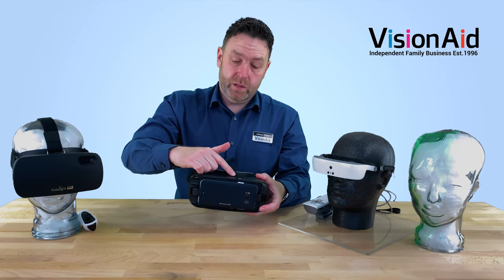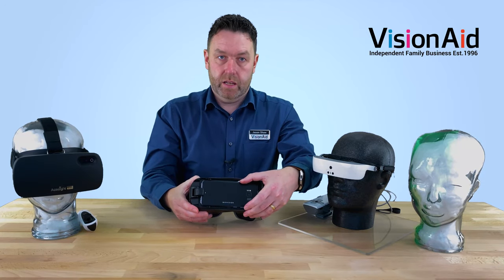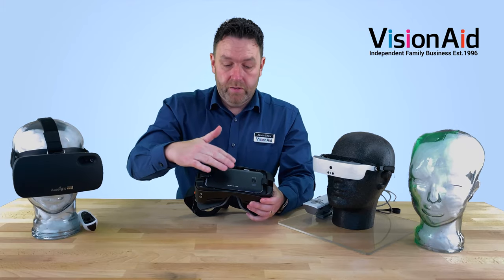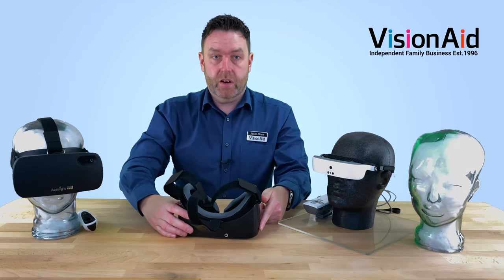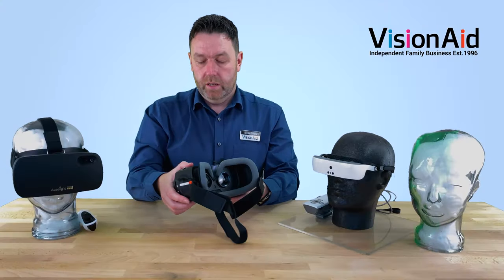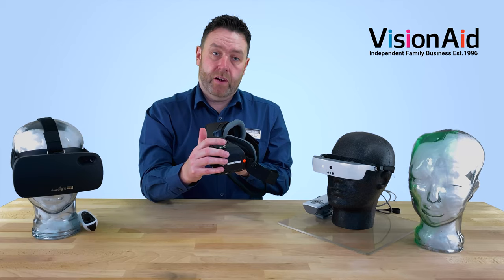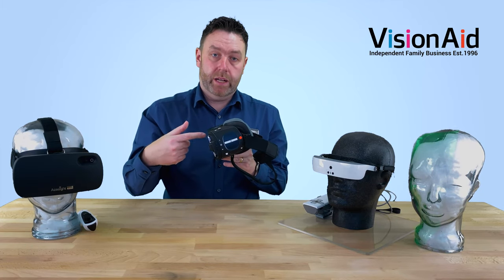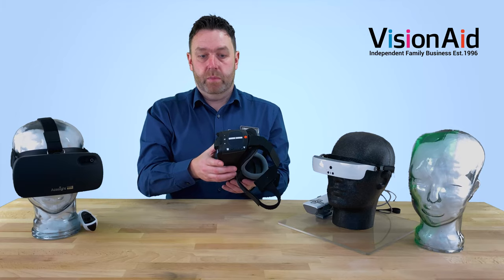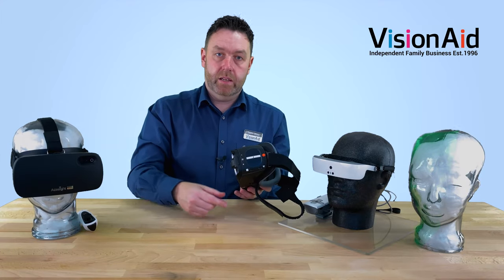We've got the same focusing wheel that we have on the A-Sight VR for setting the distance, and the power button is on the front here. This can be charged in various ways — you can take the phone out by unclipping it, or it comes with a contact charger so you can simply place the device onto it without removing it from the headset. It's also got a magnetic charging connection at the bottom. This doesn't provide enough power to fully charge the device, but it will keep it running — so if you're binge-watching Netflix or watching a long film and the battery is running low, you can connect to this and it will keep the Iris Vision running.